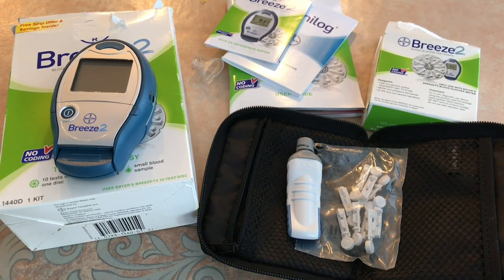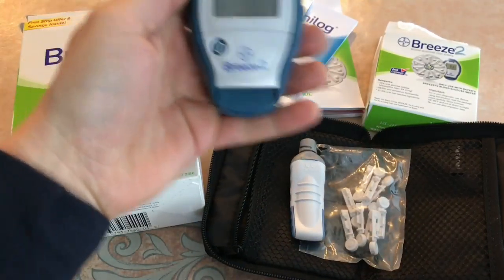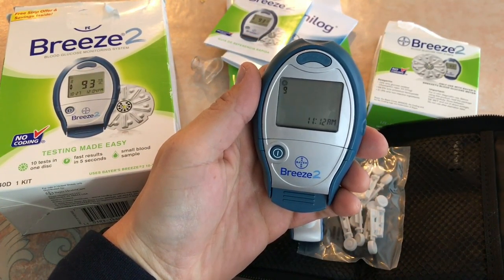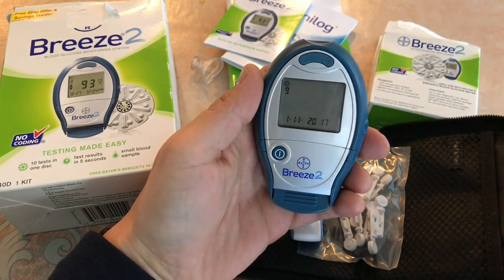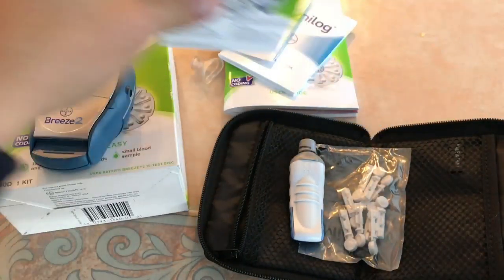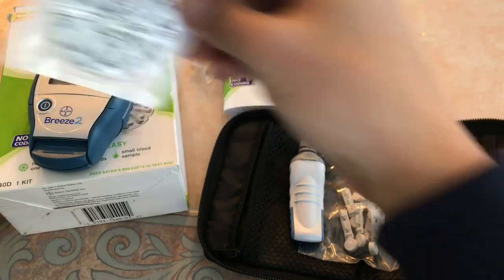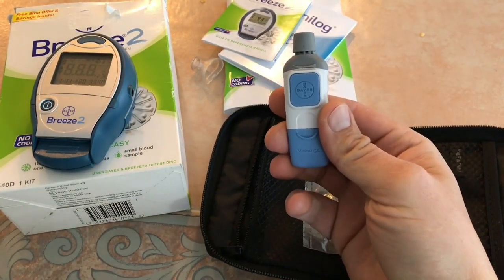Here is a new blood glucose tester I got called the Breeze 2. What I really like about this one is that inside of it — you can see there the number 9 — it holds 10 blood strips in there. It comes in this round package with sealed blood strips inside. It opens up, you place those inside, and it's super convenient.